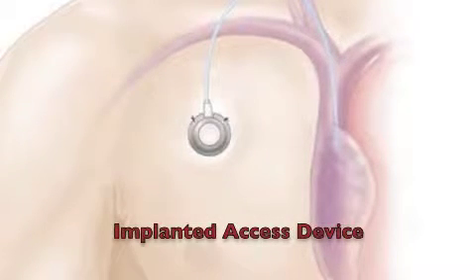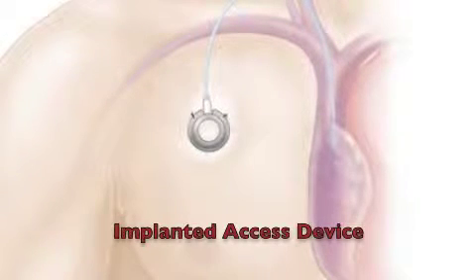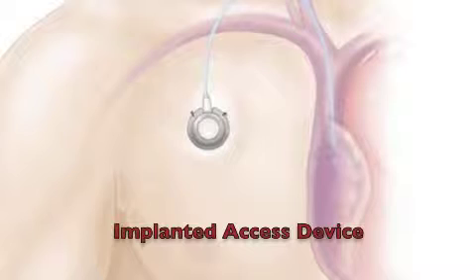Implanted access devices are actually located within the chest. There is no catheter protruding from the skin, and these are usually used for cancer patients. This concludes this portion of the video. You will now watch 2 videos on how to flush a central line and properly change the dressing.